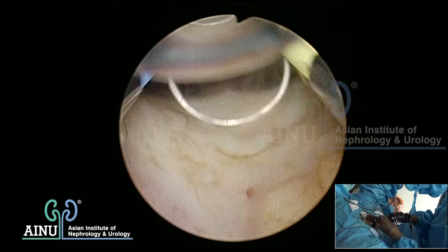Have significant control on your hand when the loop is moving towards you - don't be in a hurry. Only pinpoint coagulation is necessary; too much coagulation at every place is not advisable. Excessive coagulation produces more necrotic tissue and causes higher rates of secondary bleeding. Patients coming back with bleeding after 10 days is basically because of necrotic tissue that separates from the capsule. The air bubbles formed at each cut are the product of bipolar coagulation - common in bipolar but not in monopolar resections.